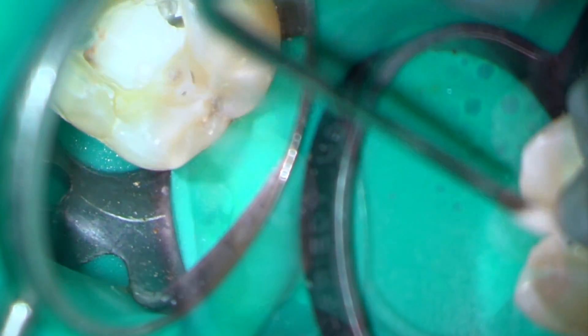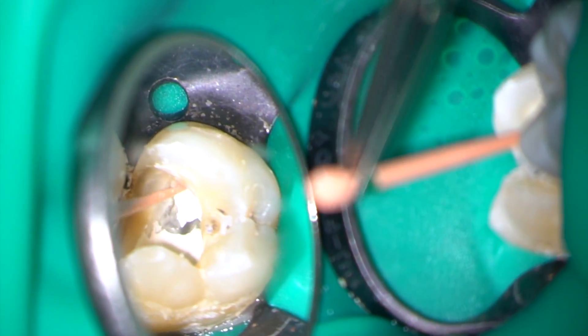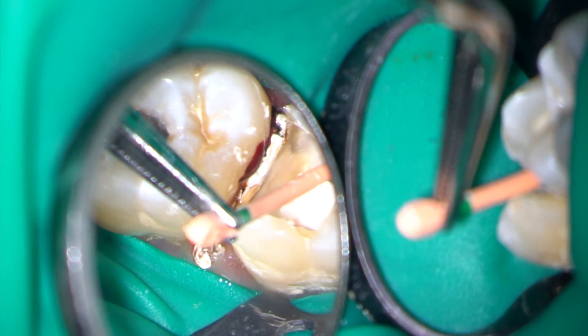Excess sealer in the pulp chamber can be removed with a 3-in-1 syringe and water spray.